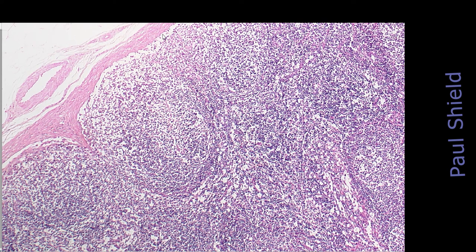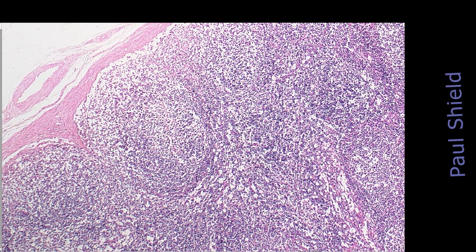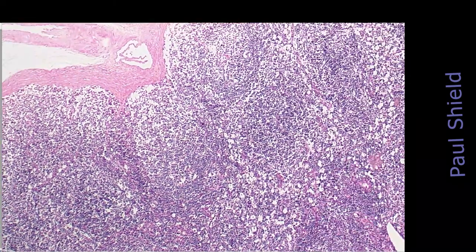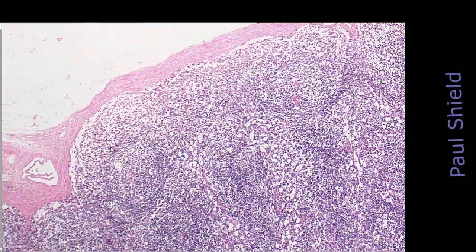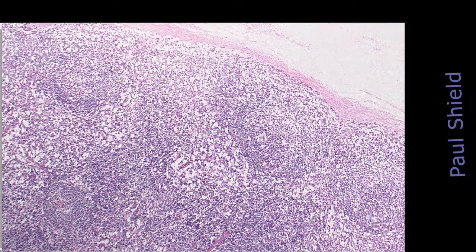So remember, it's made up of those roundish organs, and we have these round structures, follicles, arranged around the cortex, the periphery of the lymph node, with a bit of connective tissue capsule there. Notice how they've got a sort of darker area around them, and these are the cell types that are normally found in these areas. Just cruising around the outside, the cortex, you can see there's quite a lot of those rounded follicular structures.